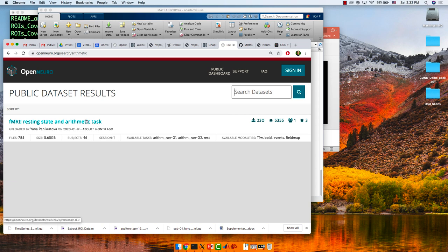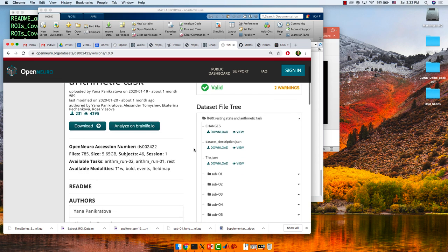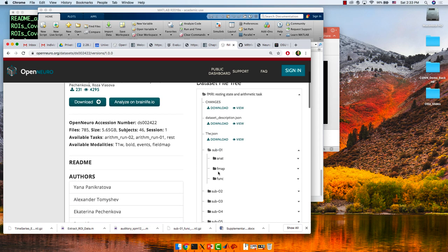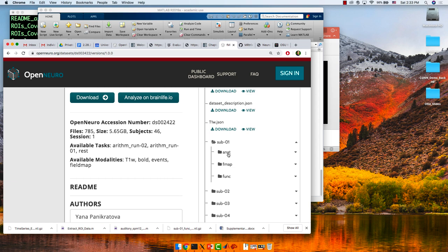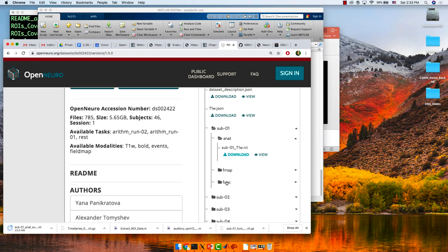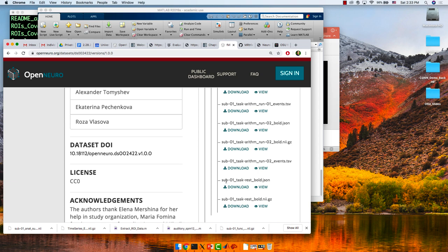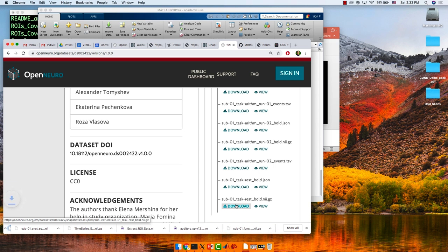We're going to be manually downloading the individual images. My plan is we're not going to analyze the entire dataset because of time considerations, but by the end of the day we'll get you going on analyzing a subset — six subjects for a group analysis. Click on that dataset, then click on Sub01. We have an anatomical file — download that. Also click on Func for Functional and download TaskRest_bold.nii.gz, which is the last image in that folder.